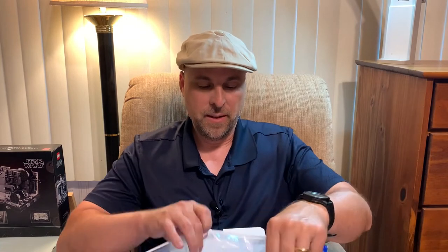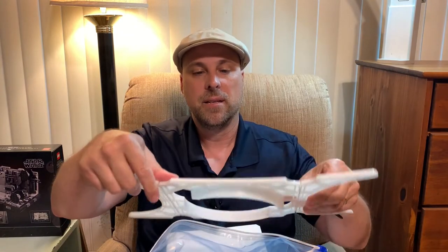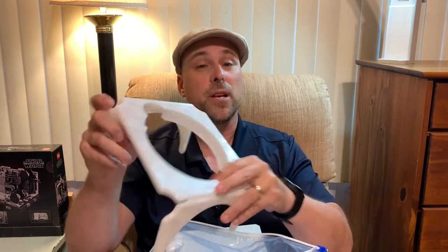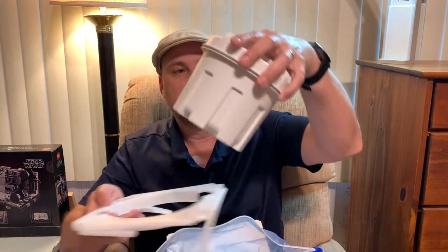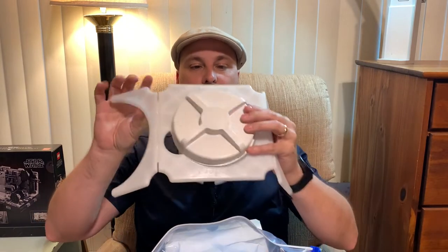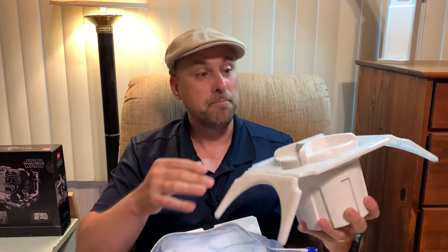This is a zipper bag — we're going to unzip it and pull out the contents. So this is the bracket. It goes under the seat of your toilet, between the porcelain and the plastic seat, and that is so that you can place your container in there and not have to worry about aiming. You just have to align it up underneath your bottom, so to speak.